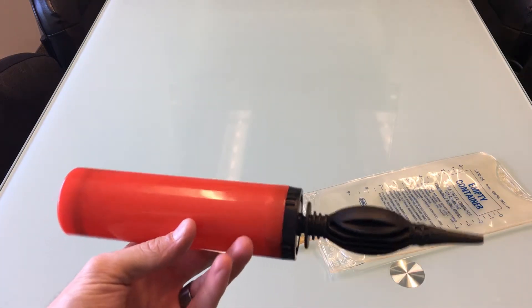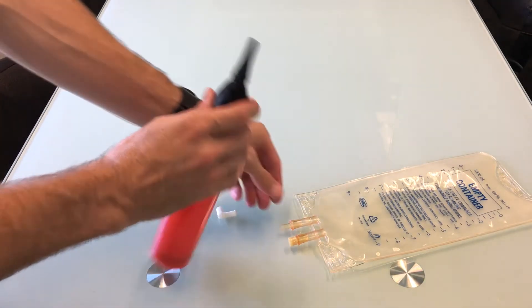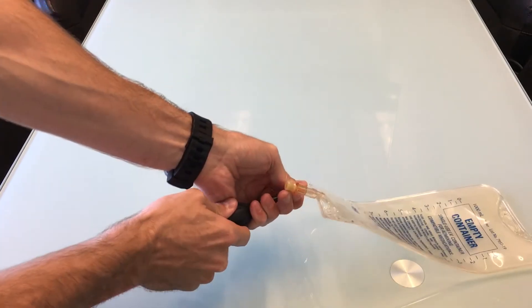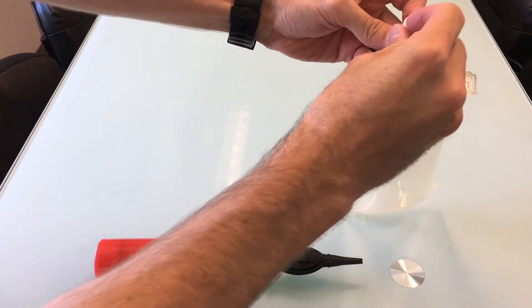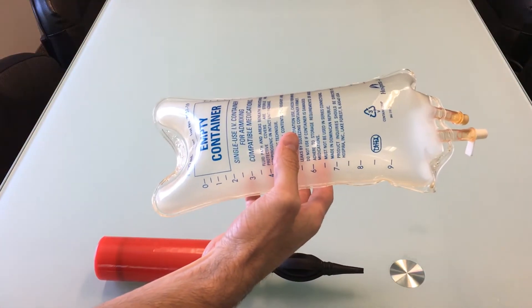A similar balloon pump has been included in your simbox for this use. Push it in as far as you can get it to go and then inflate. Put the white cap back on, and you now have an IV bag full of air ready to be used with your EBB training box.